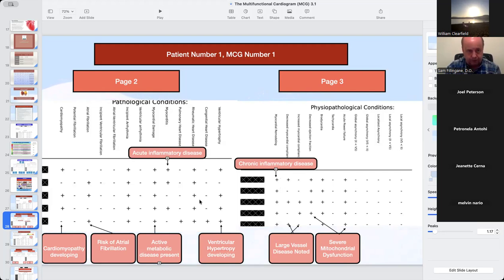Now, this physician, when we looked a little further, we want to know if he's got large vessel disease or small vessel disease. He had large vessel disease. Some of his disease was greater than 30% plaque, and some was less than 30% plaque. But even though he was only a mild disease category in category B, that's at least noteworthy.